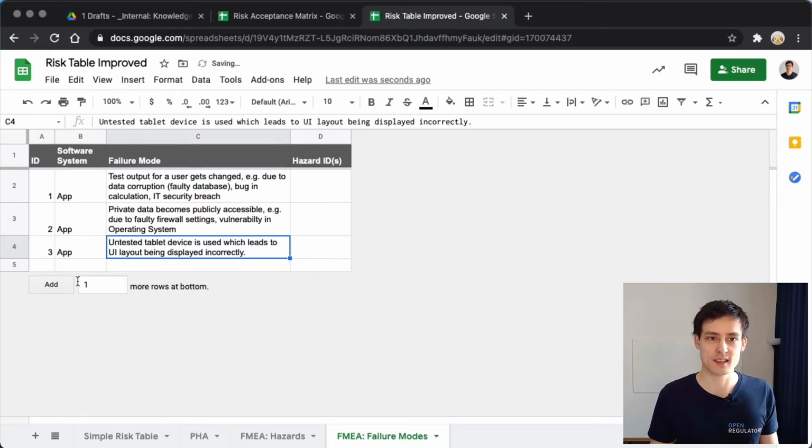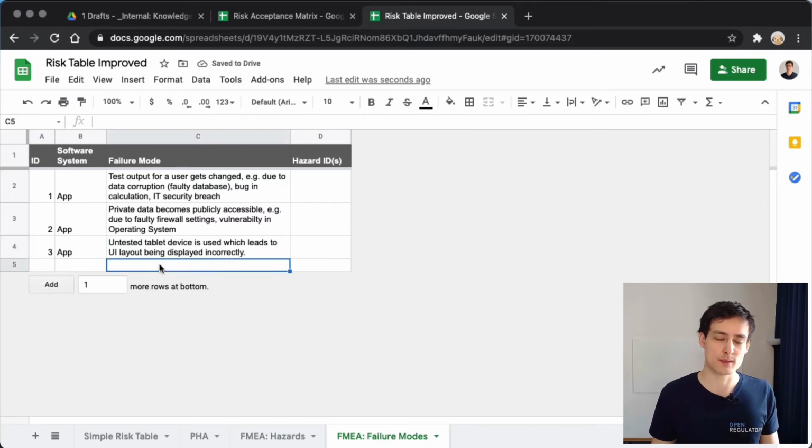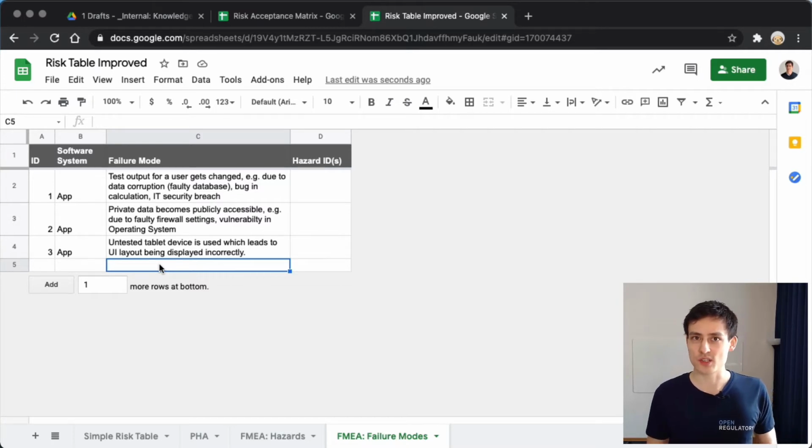And maybe something more technical. Maybe the developer would say, when the app launches, you need an internet connection because it has to connect to the super secure machine learning server, which assesses images of the patient's face for whether they have COVID. In this case, we would have a separate software system, the machine learning server, but let's not care about that for now.